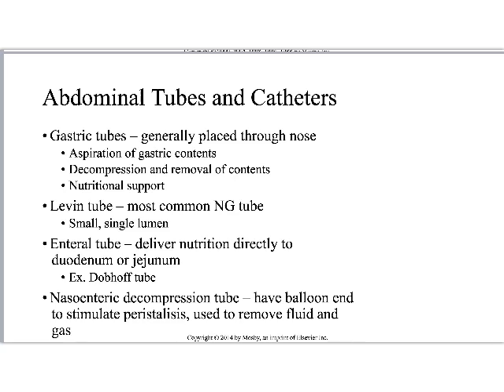Okay, gastric tubes. These are generally placed through the patient's nose. Probably some of us have an opportunity to assist on these types of things. Another way it might be called is an NG tube. They're more commonly called NG tubes, and the reason is that NG means nasogastric. We just connected your nose to your stomach is what that means, right? So pretty awkward for everyone involved.